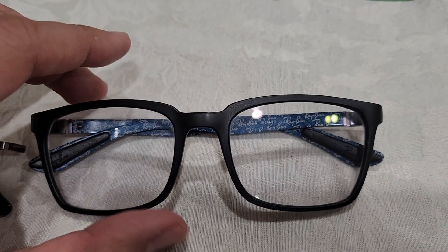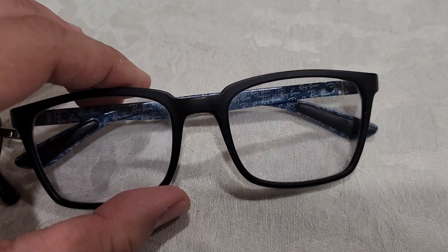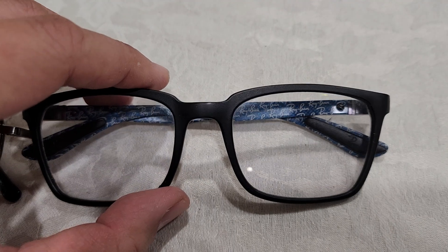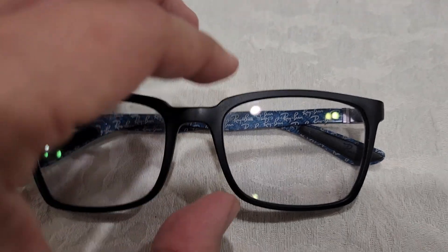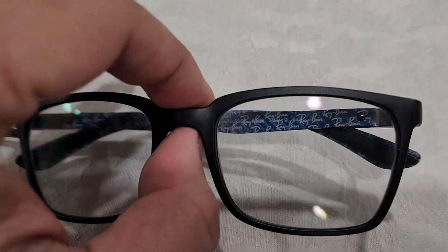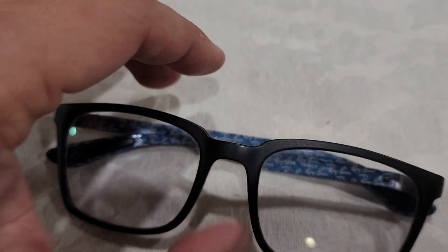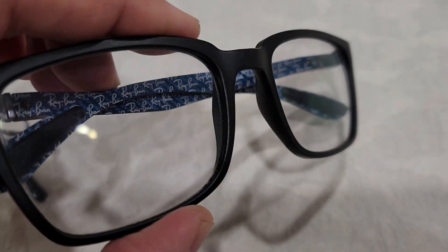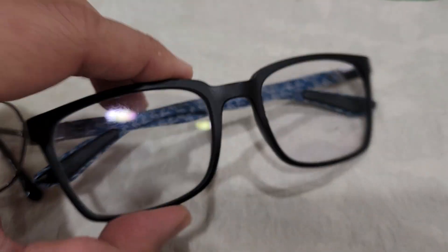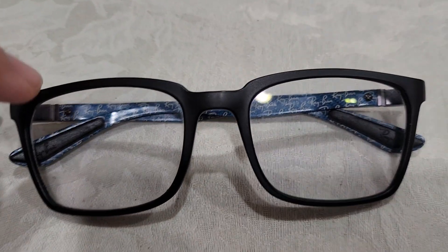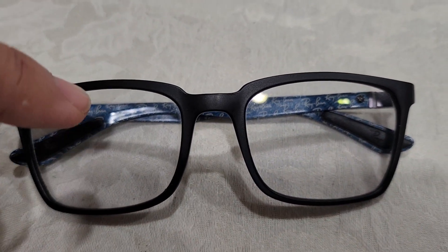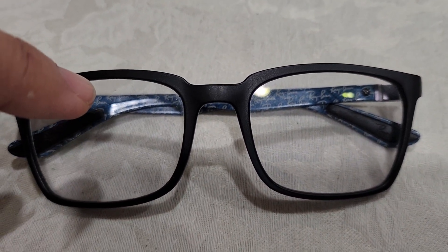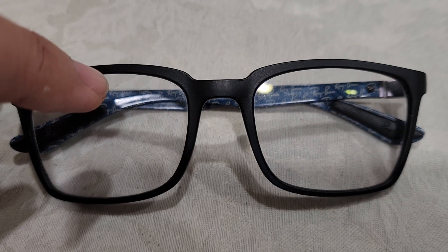So I ended up getting these glasses. These are actually called progressive lenses. They look like single vision, which is one prescription, but actually there are three prescriptions in it.